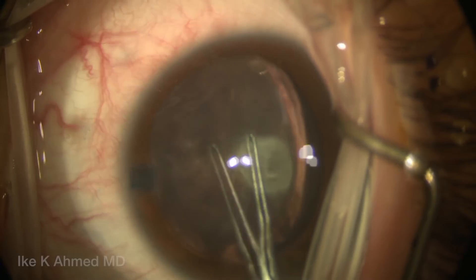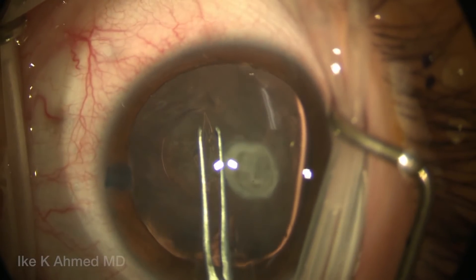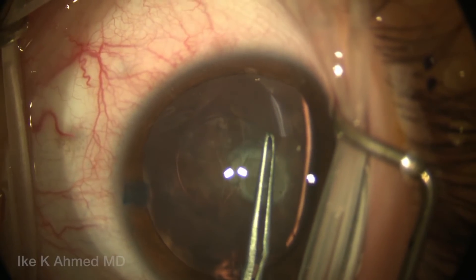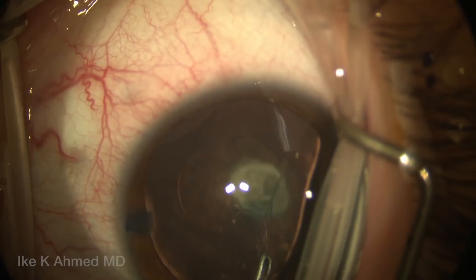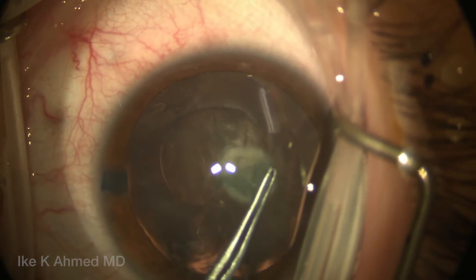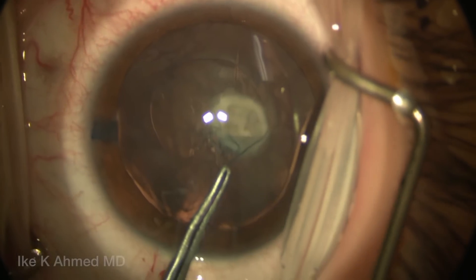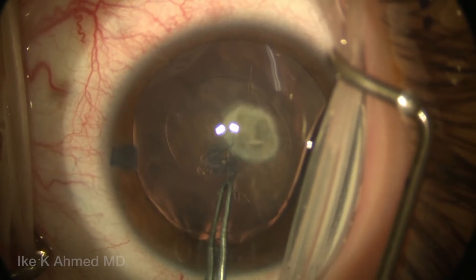You can see we're going to use a combination of both the shearing technique, which is folding the flap over, as well as stretching. At certain times we're going to unfold the flap and allow the tear to occur by stretching the capsule to propagate the tear, and this helps to prevent that rhexis from running out, which is of course a concern in these young pediatric lenses.